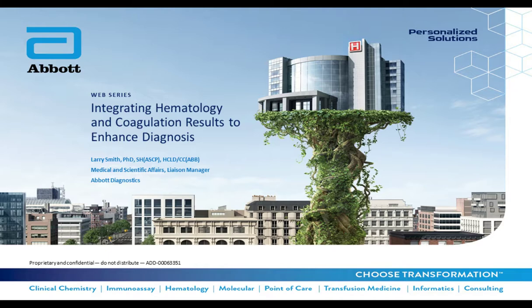Dr. Smith, do you need to perform platelet function studies with the closure time and platelet aggregometry simultaneously? You really don't have to perform both of these assays simultaneously. You may get enough information from the platelet function screen depending on what you're actually looking for.